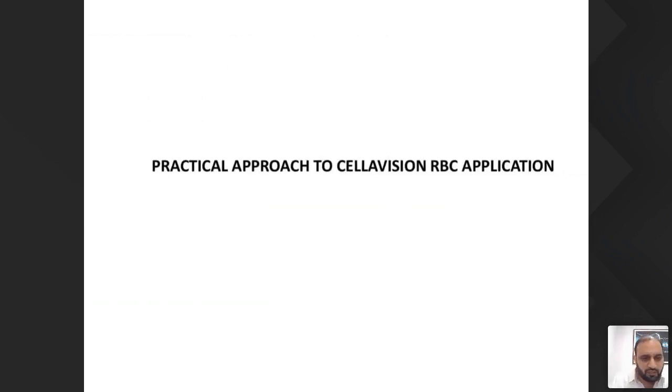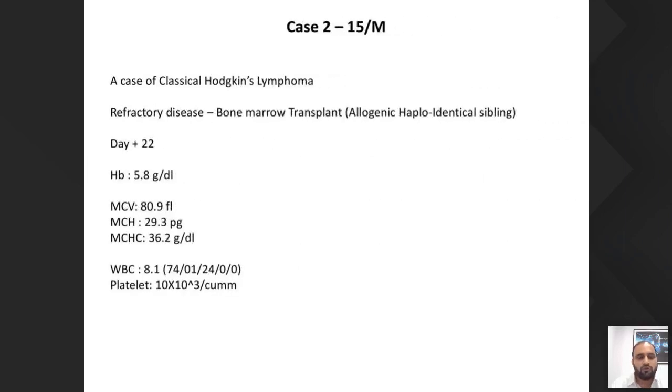With a few cases, I'd like to highlight whatever points I have put forward in terms of quantification and grading of RBC. So this is the first case. This I have borrowed from my alma mater, Tata Medical Center, Kolkata. I would like to thank them for this case, because such cases you will find only in a hospital setting. I am sitting in a standalone lab. I might not see bone marrow transplant cases, day 22 slides, coming to me.